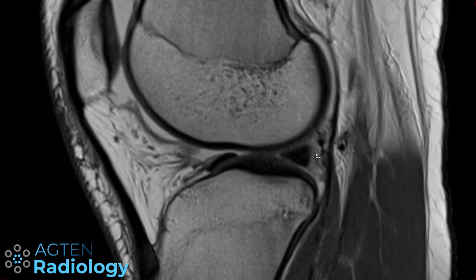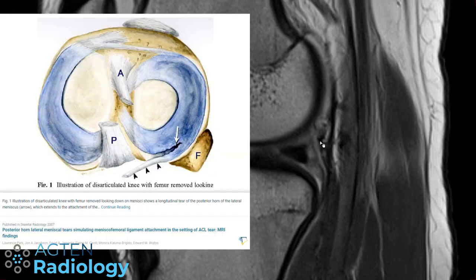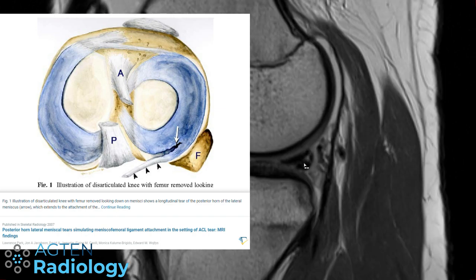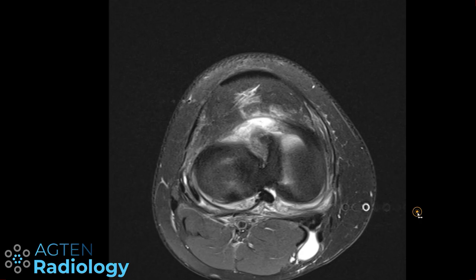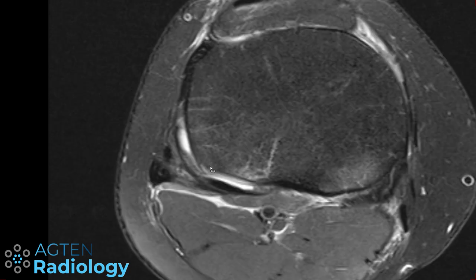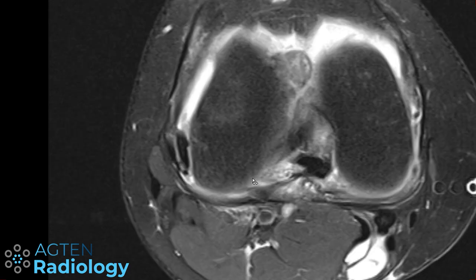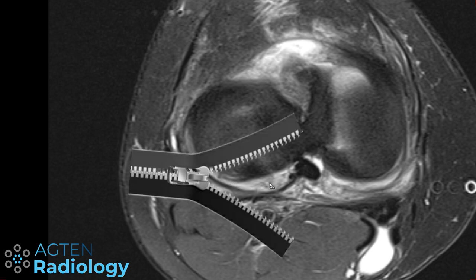So this is again a tear, sometimes called a Wrisberg rip, because the Wrisberg ligament rips or tears on this portion of the meniscus. And some use the term zip sign, because it's like a zip or the zipper on your jacket. We can try to see this here. This is the lateral portion of the knee. We go up. We can try to see here the Wrisberg ligament, and normally it attaches somewhere at this level here, back to the meniscus, and here it goes on and on and on. So this is like a zipper here of the meniscus. It's a longitudinal tear here all the way.